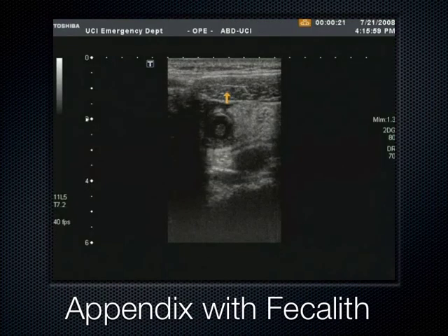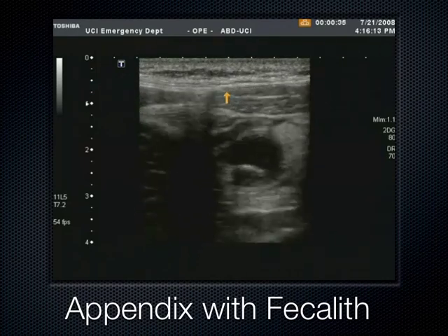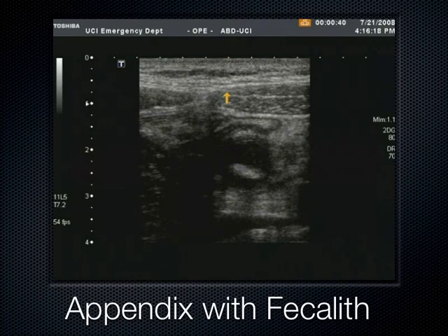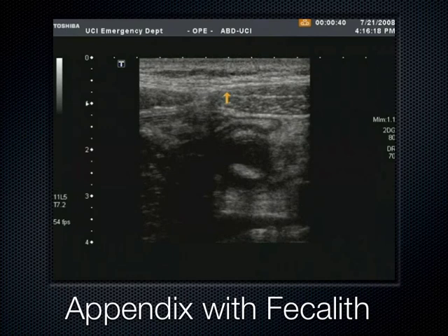One last example of appendicitis — the characteristic blind-ended tubular structure, with psoas smooshing the appendix between two muscle structures. This one has a little fecalith inside — literally 'poopstone' — which obstructs the opening of the appendix, causing it to expand. It can't drain its contents, pressure builds inside until it exceeds the vasculature's ability to supply it, leading to ischemia. Eventually the wall perforates and contents spill into the peritoneal cavity. Once perforation occurs, surgery is often not beneficial and the patient gets antibiotics for a couple of weeks.